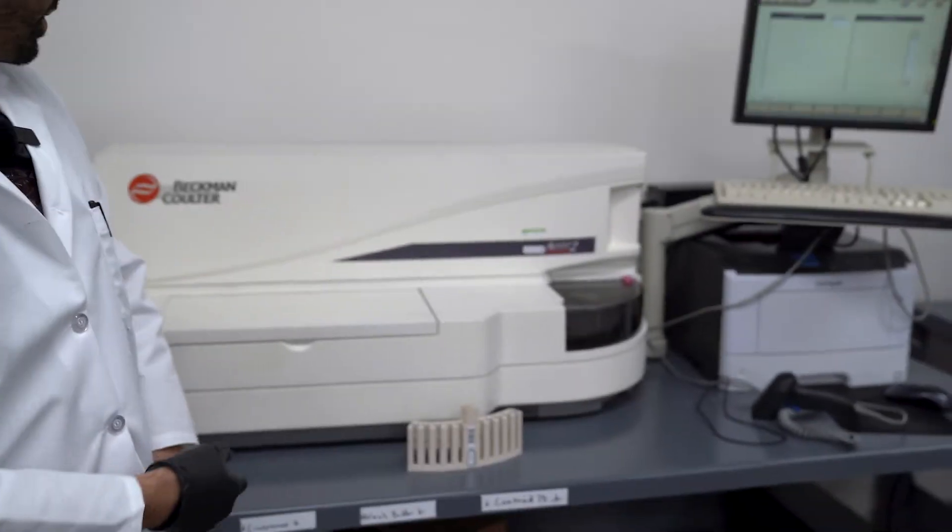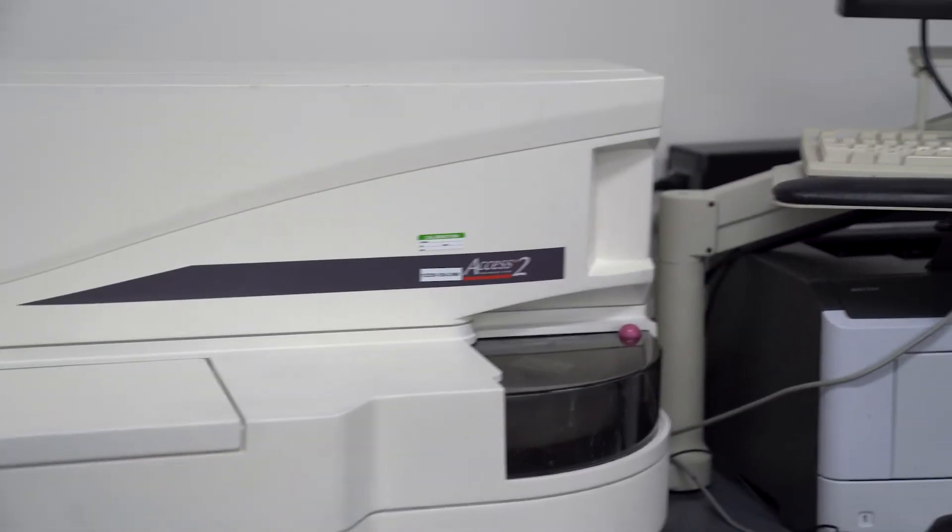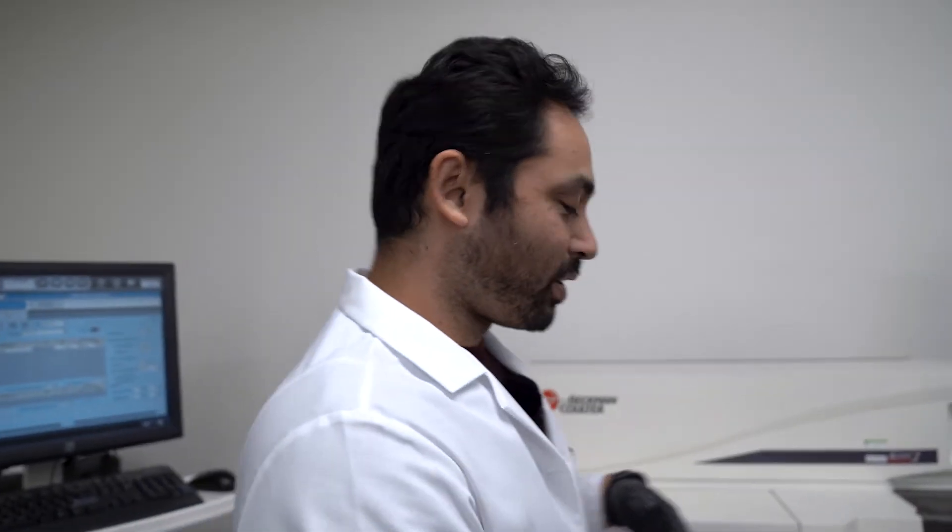Today I'm giving you guys access to the IA machine — that stands for immunoassay. We're going to show you how to do the maintenance on this instrument so you can get it ready for your daily run. Let's get to it.